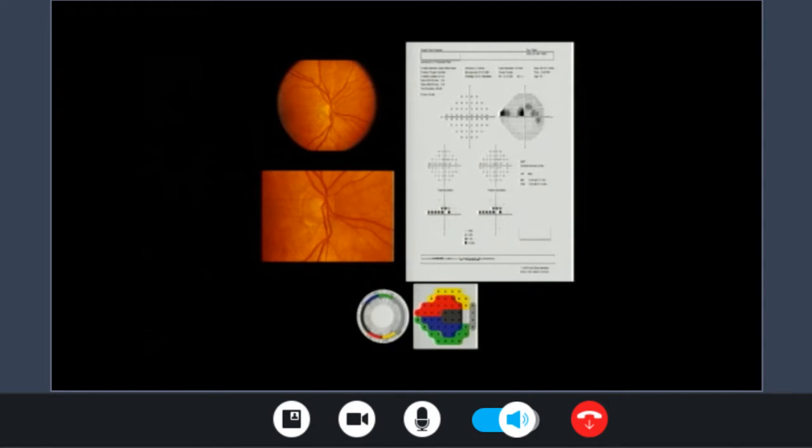Now, once we finish these things, how would I rank my glaucoma patient? What kind of damage is he having? Now, the mean deviation here is minus 3, and the pattern standard deviation is 7. So the pattern standard deviation is more than 2. It's 7. Why is that? Because you have irregularities of the patient's visual field health. One area is significantly damaged, other areas are normal. So there is a significant dip here. That's why the pattern standard deviation is high.